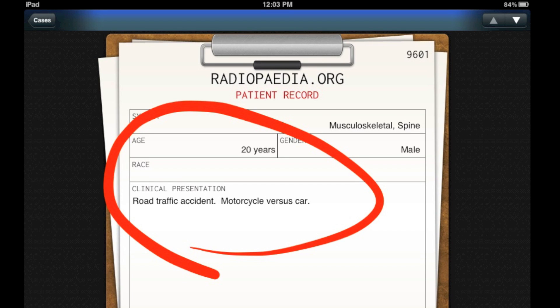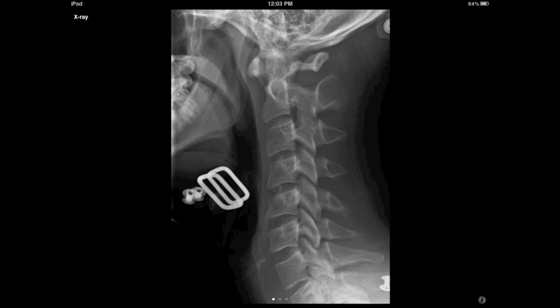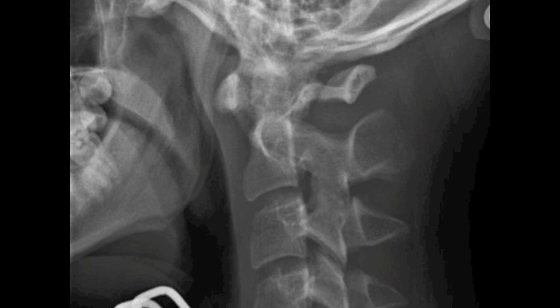Here's a case from our iPad app of a 20-year-old male involved in a motorcycle accident. Here's his lateral cervical spine radiograph, and we'll zoom in to show you some of the abnormalities.